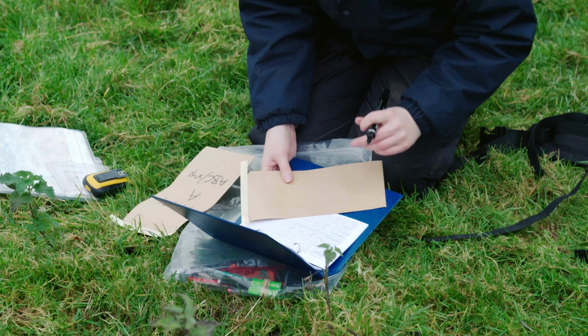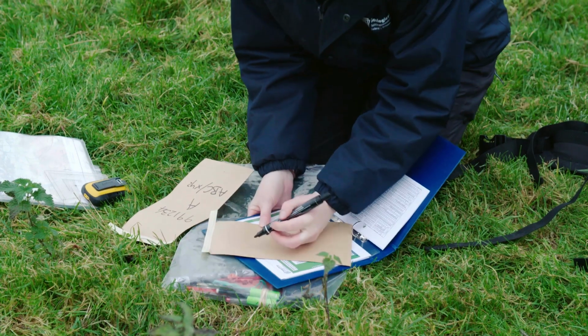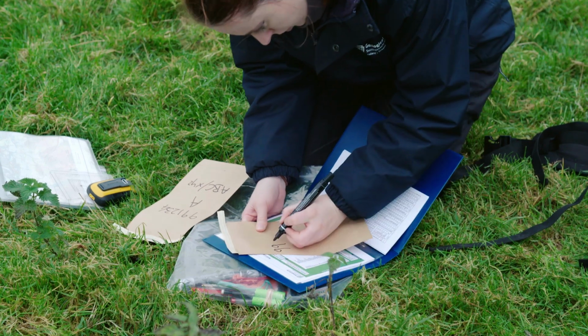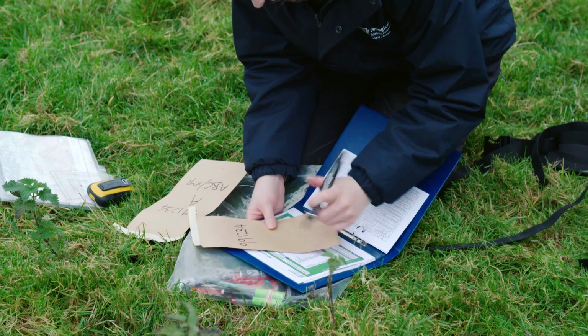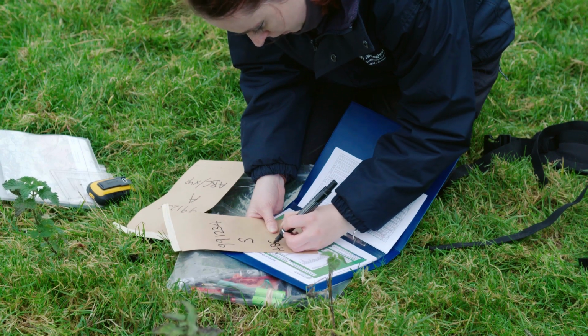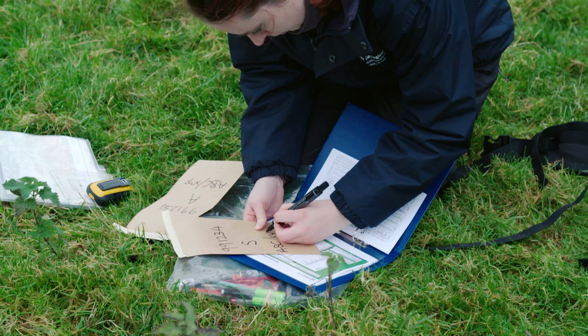Before beginning any sampling, all the large brown craft paper sample bags need to be labelled at the same time by the same sampler. Label bags with the 6-figure site number, approximately 1/3 down the front of the bag. On one, write the letter A below the site number, and on the other, the letter S. Underneath, write your own initials, followed by the initials of your field partner.